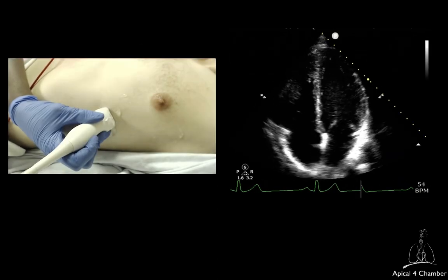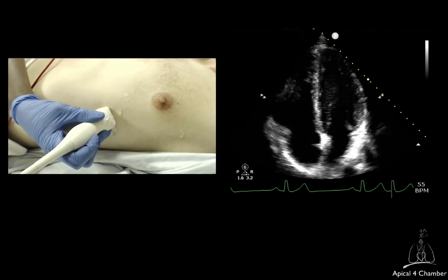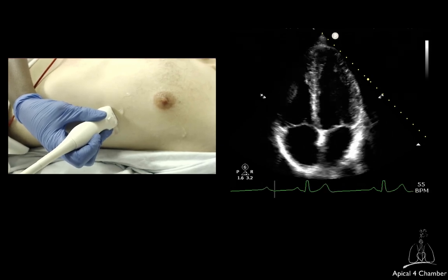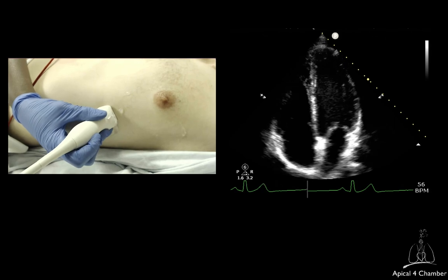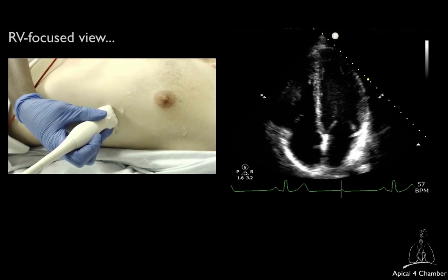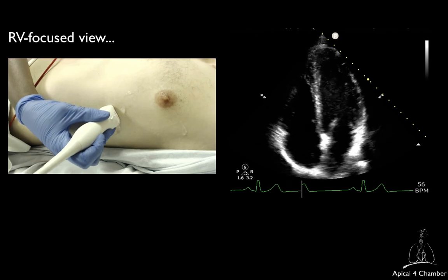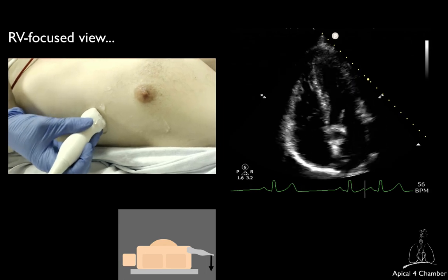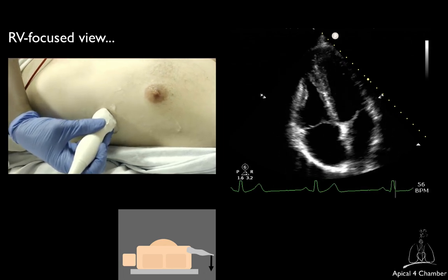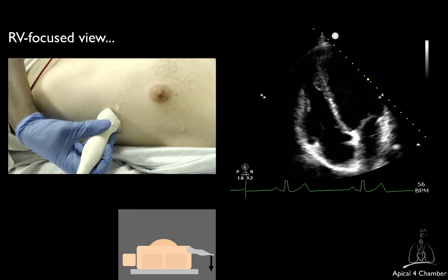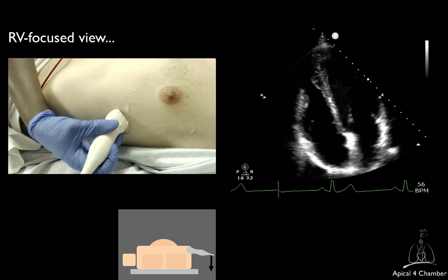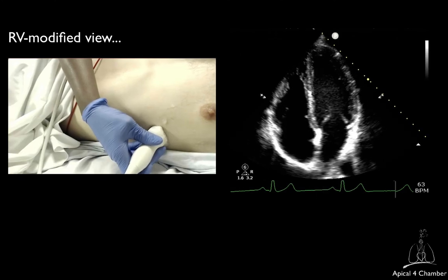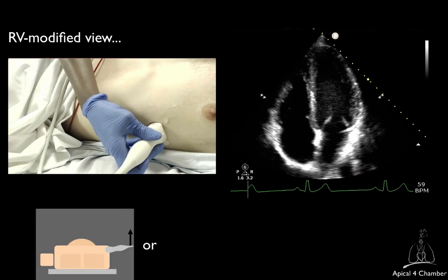Two modifications of the apical 4-chamber have been described to improve assessment and quantification of the right ventricle: the RV focus view and the apical 4-chamber modified for the right ventricle. To obtain the RV focus view, start from the apical 4-chamber and tilt the transducer tail even more laterally, therefore directing the ultrasound beam toward the right ventricle through the left ventricle. For the RV modified apical 4-chamber, tilt the tail more medially or slide slightly medially.